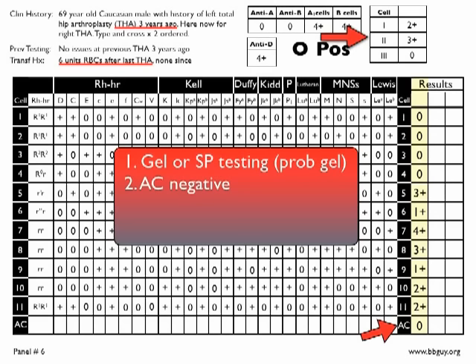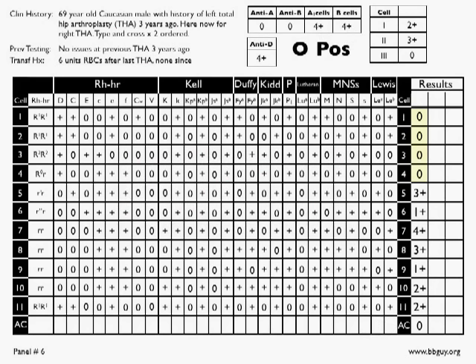Next, we see that we have a highly variable pattern. Take a look at the reactions on the right highlighted in yellow, and you'll see zeros in the first 4, but you've got 1, 2, 3, and 4 pluses across the board. Again, given this fact that we have a highly variable pattern, this is almost certainly multiple IgG alloantibodies. Okay, do our cross-offs, same as before, and what do we get? Well, we get a surprising number of antibodies that can be ruled out at least once with a double dose, single slash, and in some cases, more than one.